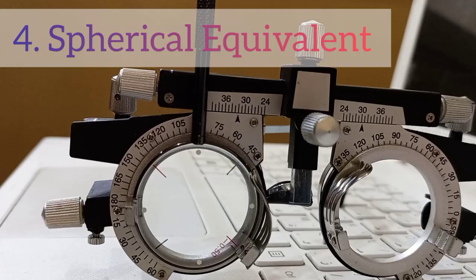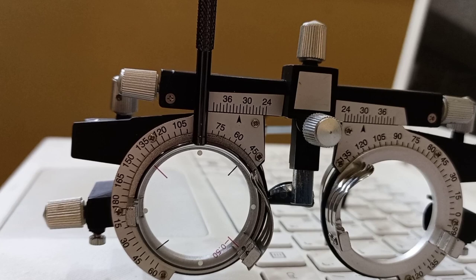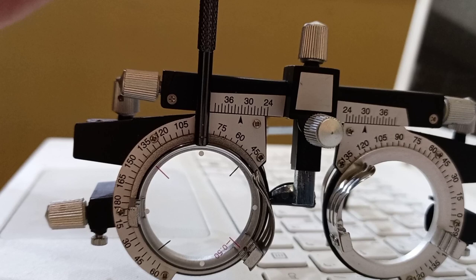The first step of the Jackson cross cylinder procedure is called bracketing. In bracketing we will find out whether our patient is astigmatic or not.